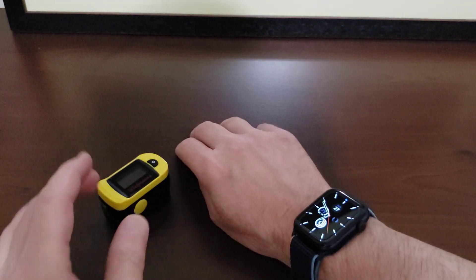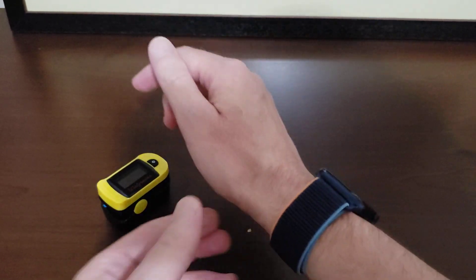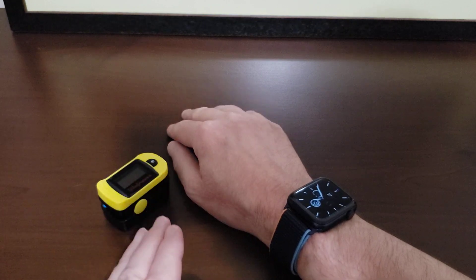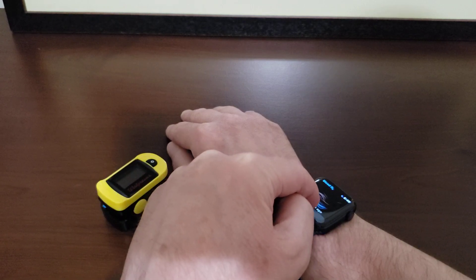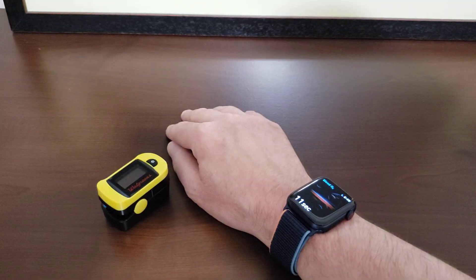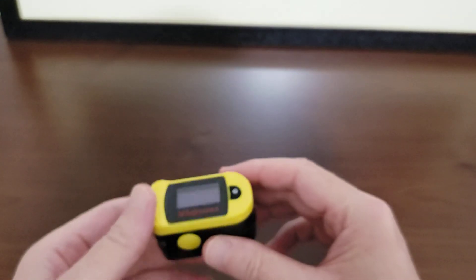First I'm going to take the pulse ox with the Apple Watch Series 6. You don't want to have it too low on the wrist — it'll tell you that when you first set it up. Put your wrist on a flat surface, remain still and quiet. I'll press the pulse ox complication, press start, and it takes 15 seconds. Pulse ox: 98% according to the Apple Watch Series 6.